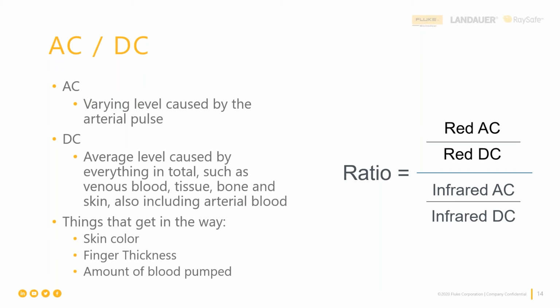They'll draw a blood gas sample, send it to a clinical lab or a stat lab nearby, wherever the patient's being treated, and get the blood oxygen level and other values from that blood gas draw. That's clinically what will happen when we have difficulty with the non-invasive technology giving us a measurement that's believable based on the other things that are happening at the moment in that clinical situation. So just understand these are some of the things that can get in the way.